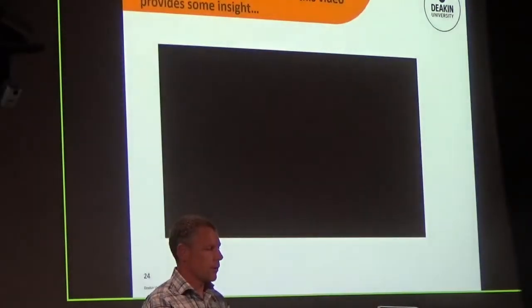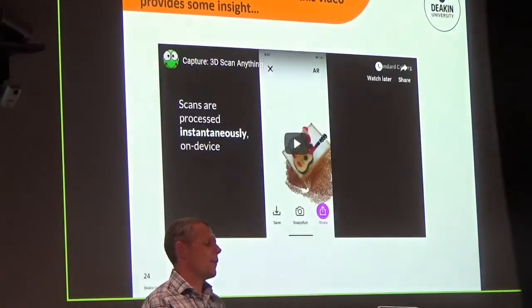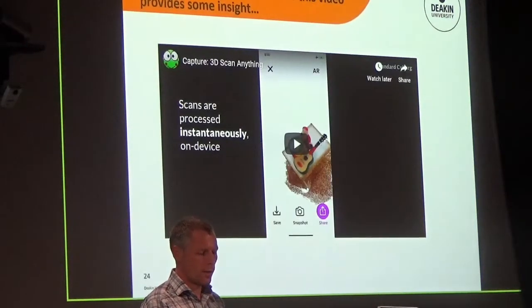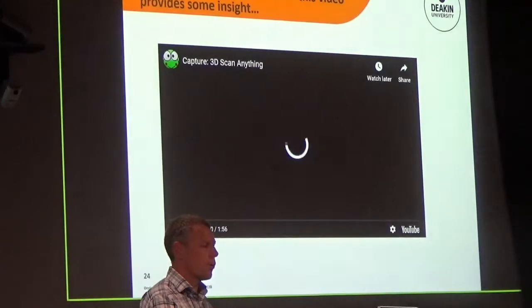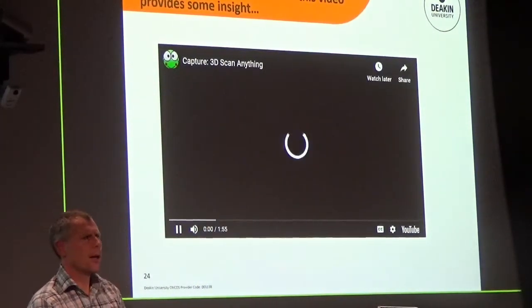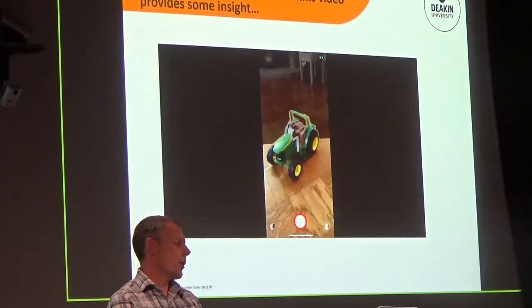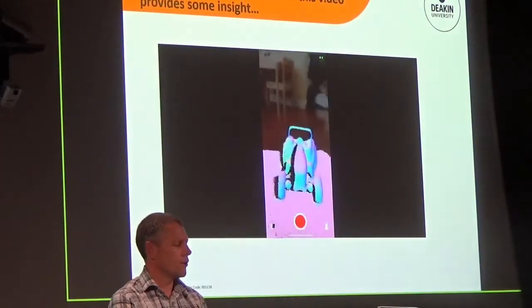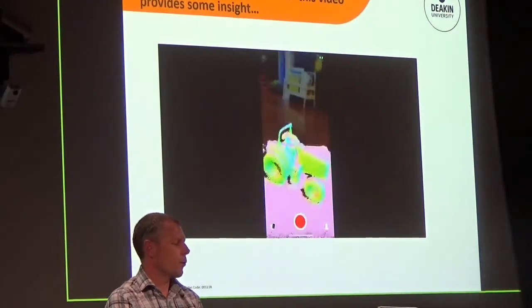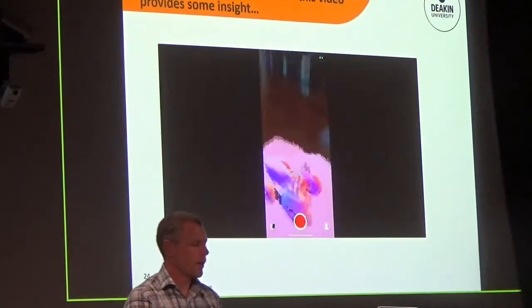So, just as a quick play, hopefully, there it comes. This is just a quick bit of how they do it. So this is through a phone, showing the scanning process. Here we go. And this is through looking through a phone, and it goes into that mode and whips around fairly quickly, and they start getting a 3D image of this.